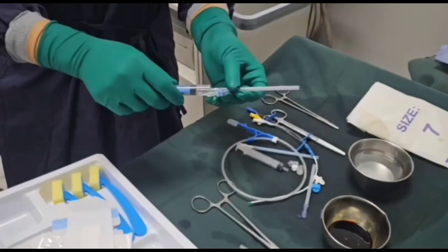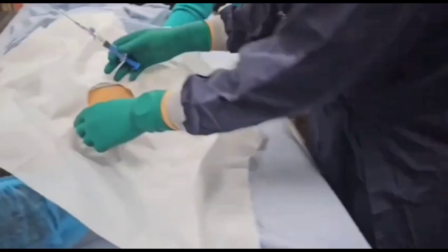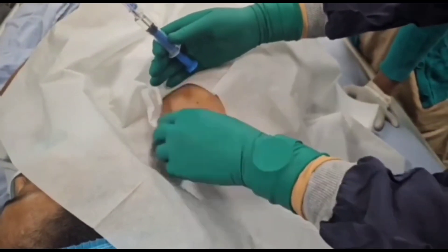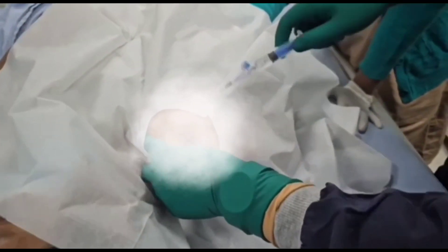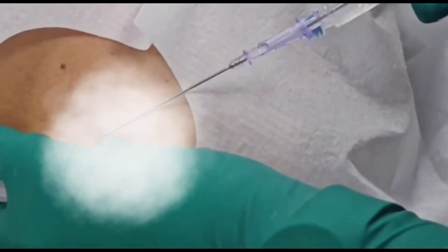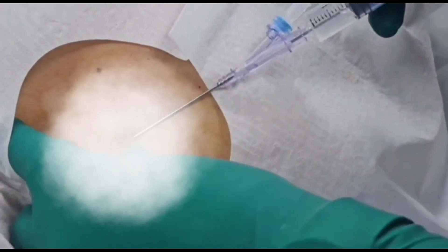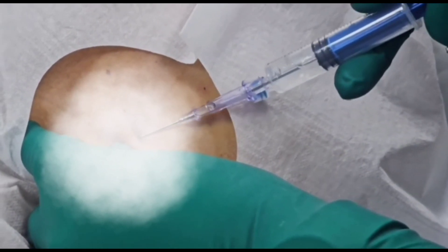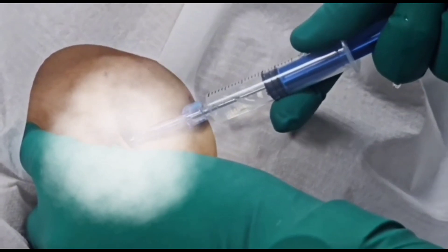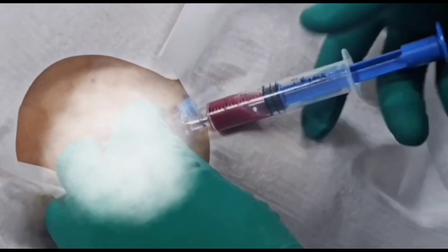Then we take the needle, which is usually medially directed. By finding the puncture site, we introduce the needle and advance it towards the suprasternal notch with negative suction pressure over the plane of the skin.